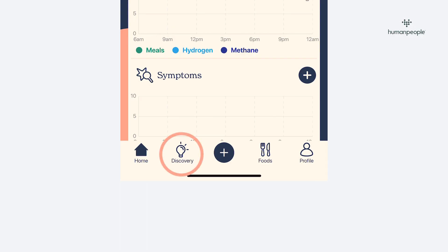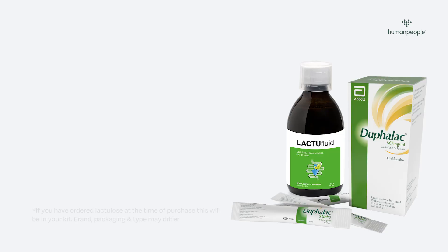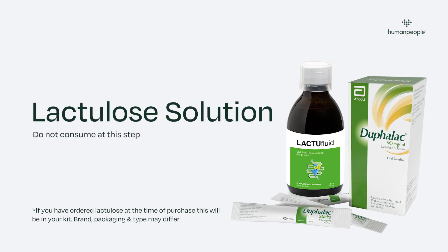The Discovery icon at the bottom of the app is where you'll find the challenges. Challenges enable you to submit a breath test using the device. For SIBO patients, you'll need to prepare the lactulose solution prescribed by HumanPeople — make sure you contact them if you're unaware of this step.